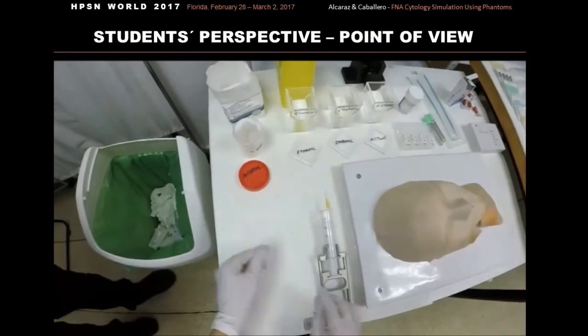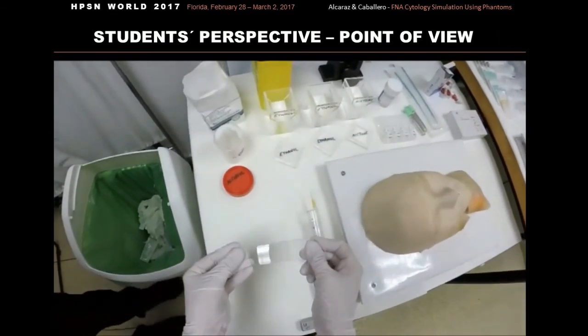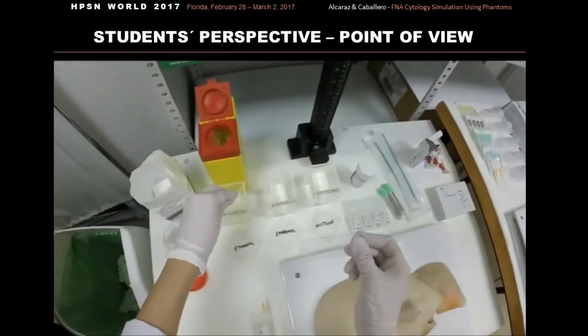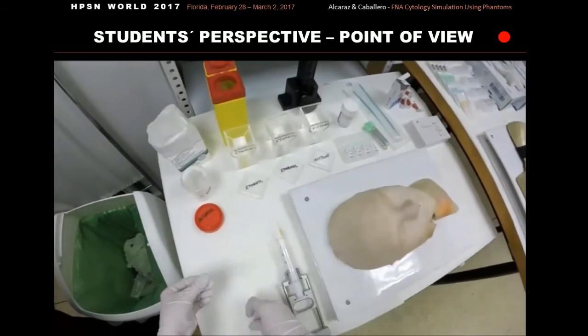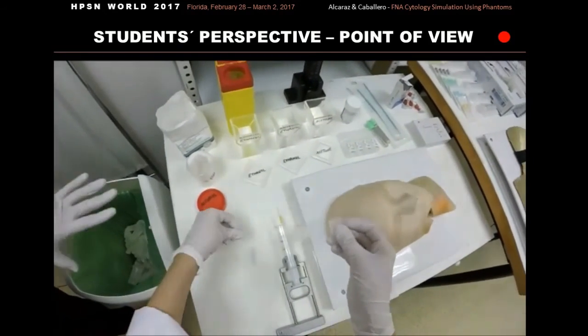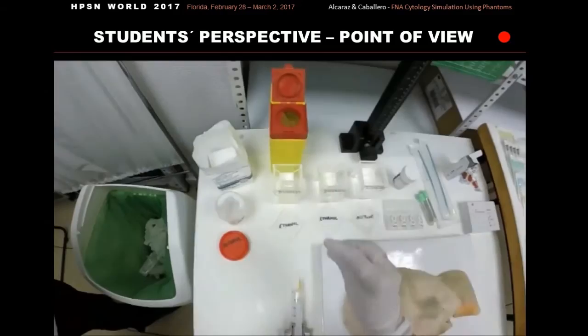This is important because if it's too much, cells are destroyed, and if it's too soft, the sample has too many layers, gets blurred microscopically, and is difficult to diagnose. They have to introduce quickly the slides inside the alcoholic solutions before they get dry.